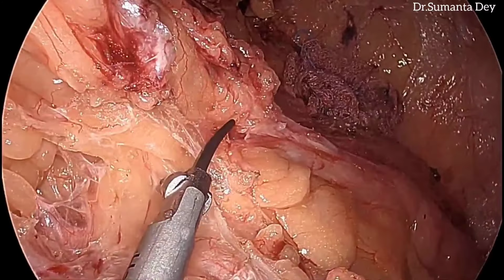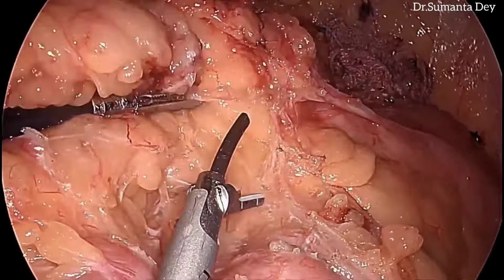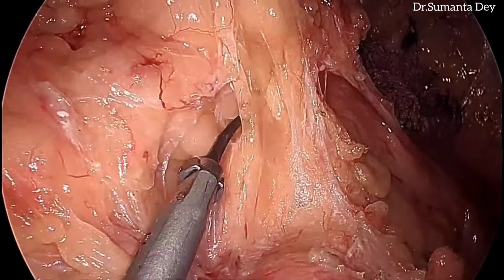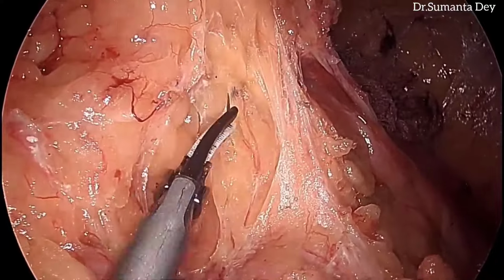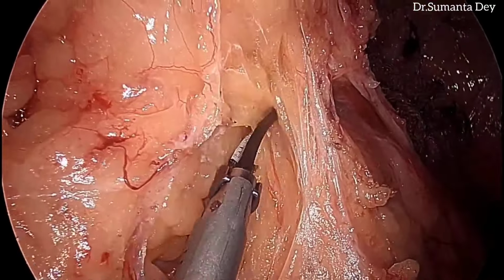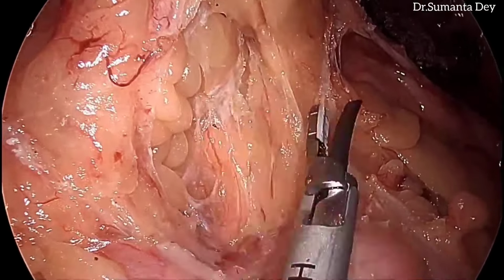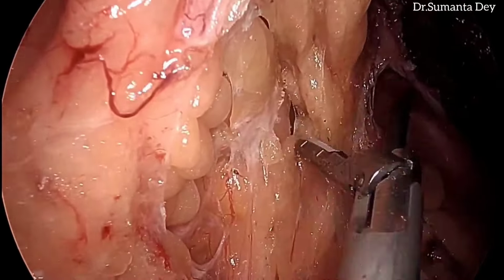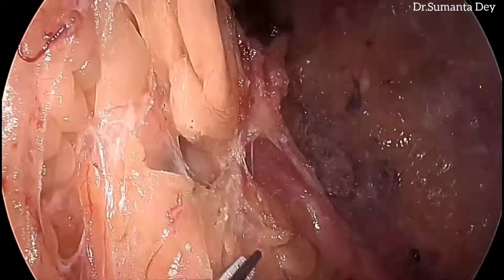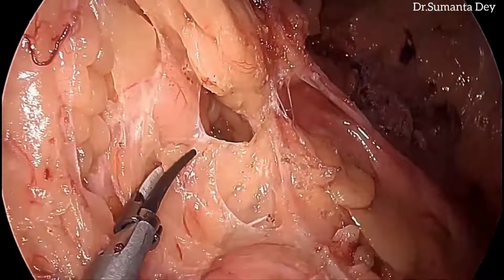So I have already kept one gauze piece in the lesser sac through the window that I have created from the superior border of the pancreas. So once I see that gauze piece, I'll be sure that I have entered into the correct plane. So in this way I am mobilizing the distal transverse colon and going gradually towards the splenic flexure.